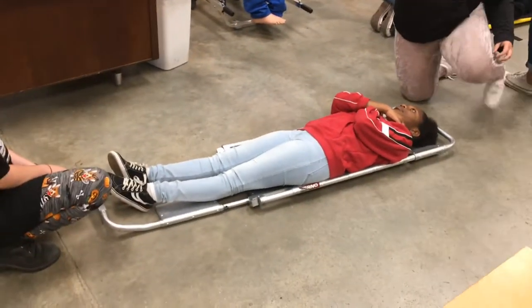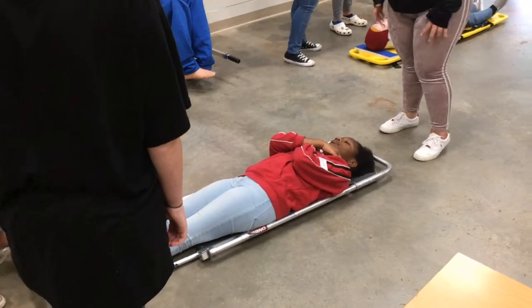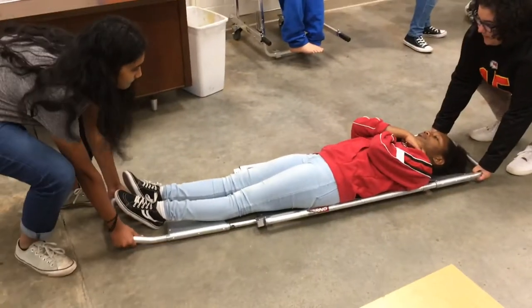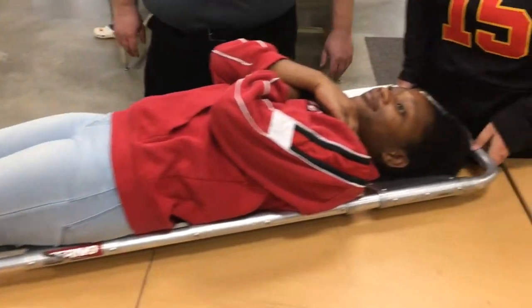Then you're going to want to lift the scoop stretcher by the end carry method. You want one person at the head end and one person at the foot end to lift, and then gently place the stretcher onto the ambulance.